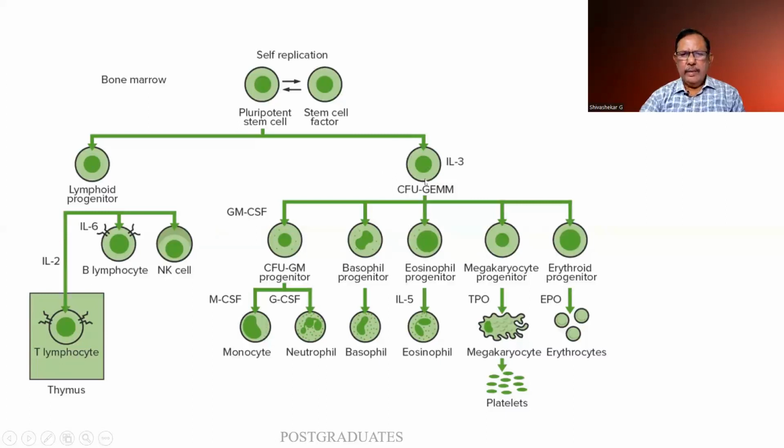This is the basis for a stem cell leukemia. And in a case of chronic myeloid leukemia, why do you find all the cells? Because the defect is somewhere over here.